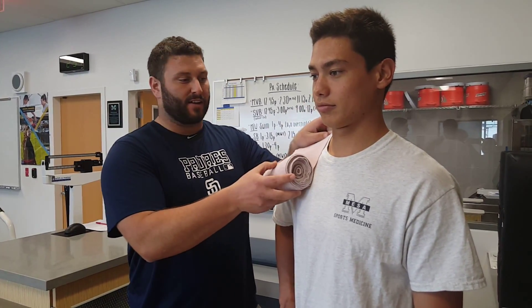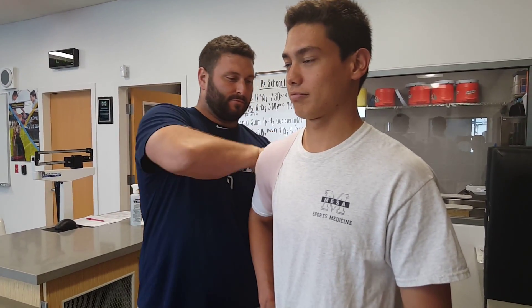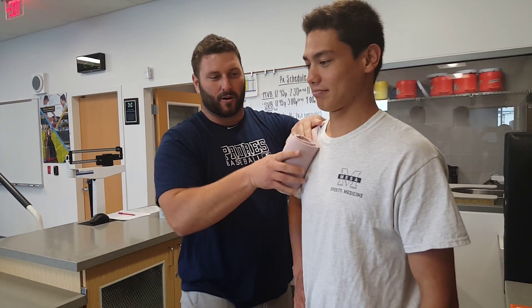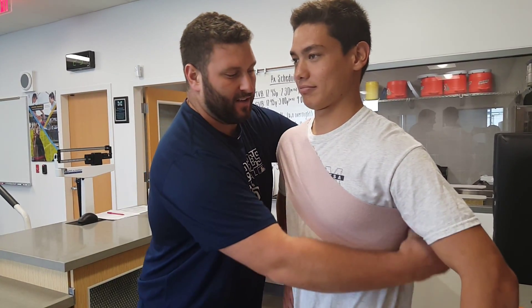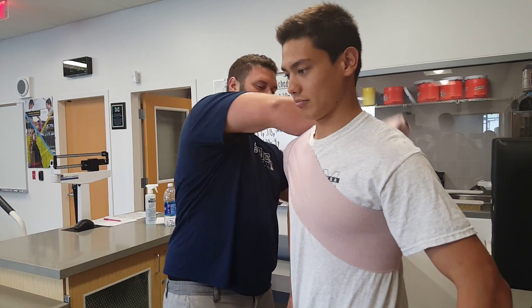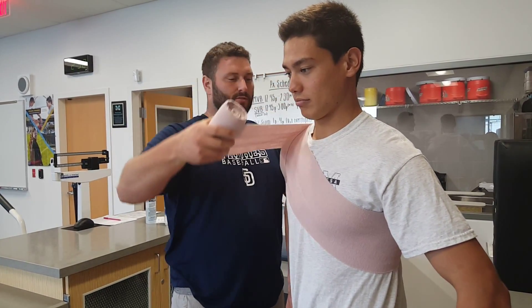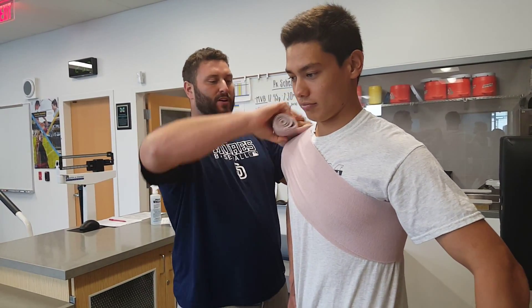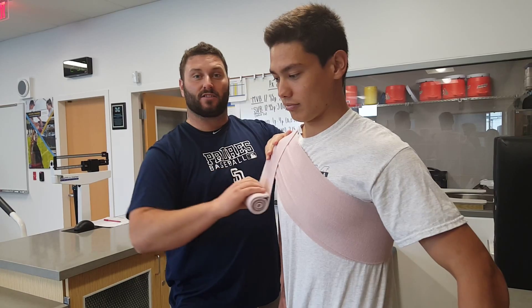I've got a double here so it's a little bit bigger, but we're going to start on top of the shoulder and I'm going to start this wrap myself. I start here on top and pull it down and around the armpit, getting it nice and tight. We'll work around the body underneath the opposite side and continue in this motion. The key here is to continue wrapping and to pull into internal rotation.